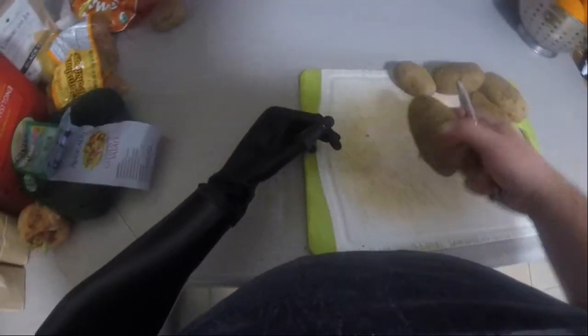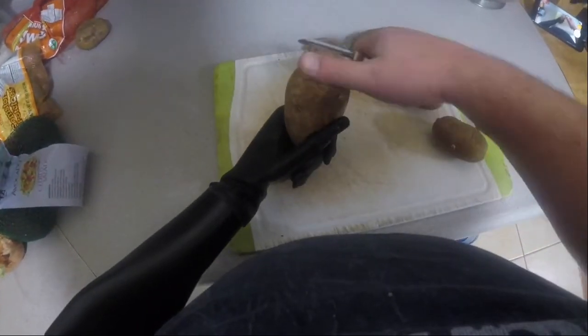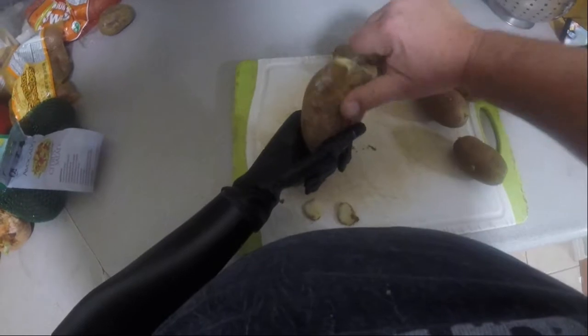Hey everybody, this is Hook Tiki here with the arm cam to show you my mind-controlled advanced prosthetic arm in use performing an everyday task that we're all familiar with: cooking.